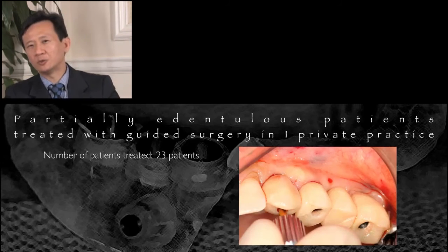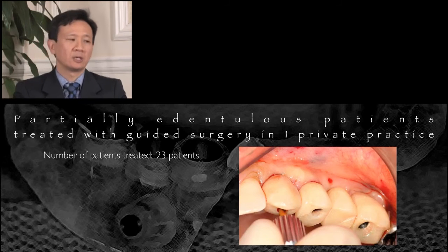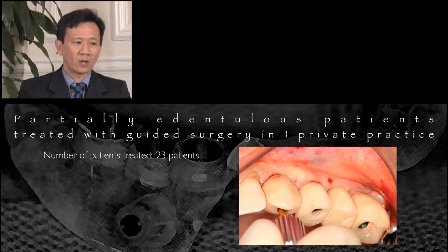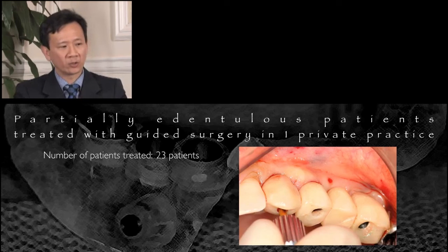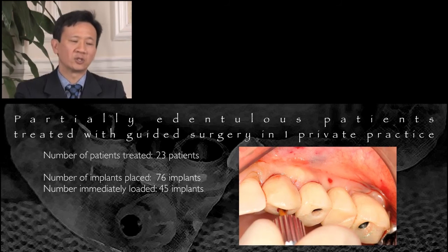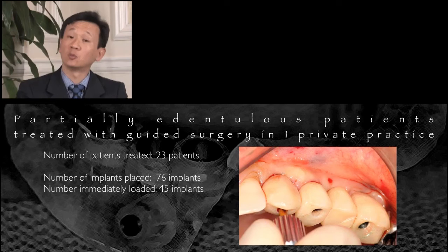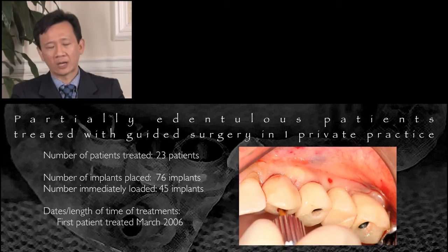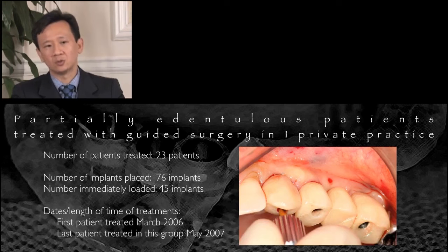Well, we've also been doing other treatments and follow-up of the partially edentulous patients. In my practice, we've been treating 23 patients, placing 76 implants through the guided treatment, of which 45 implants were loaded from the time period of March 2006 through May 2007.